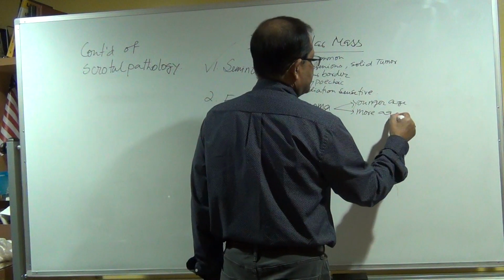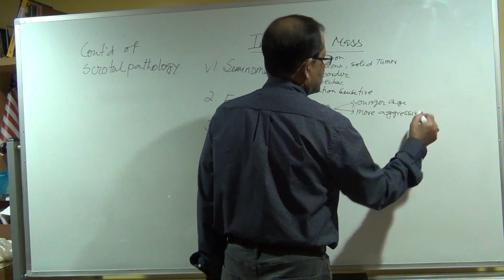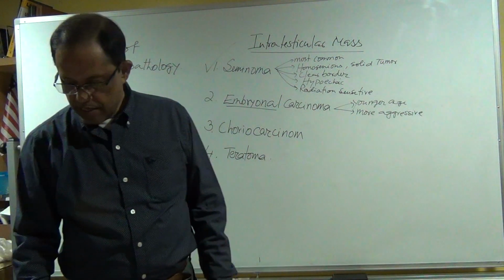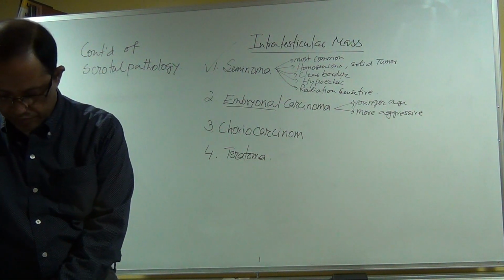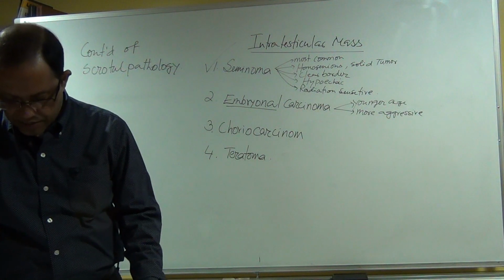More aggressive. It feels like it's going to grab the whole testis. The borders are not clearly seen.